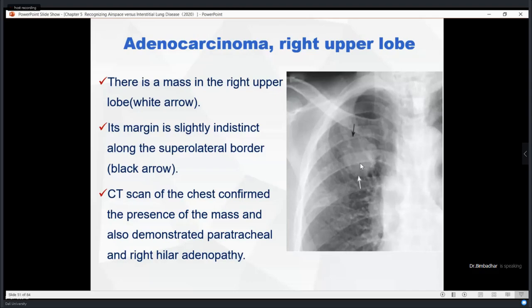Even though it is occurring in the apex of the right lung, I generally do not call this a Ghon focus, because there is a difference between the granulomatous reaction, liquefactive necrosis, or the caseous necrosis that is happening in a tuberculosis patient when compared to people with adenocarcinoma.